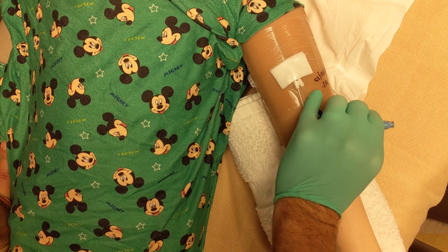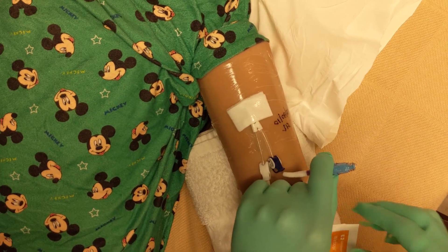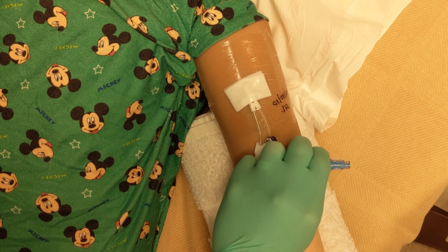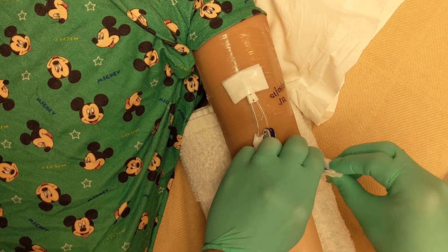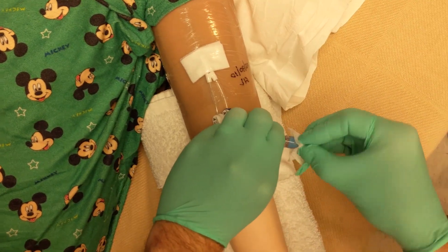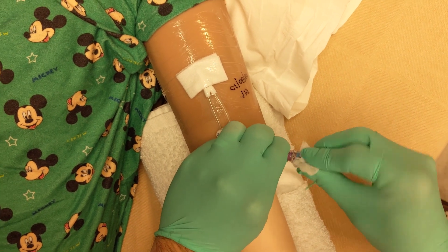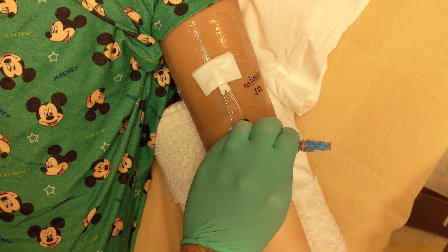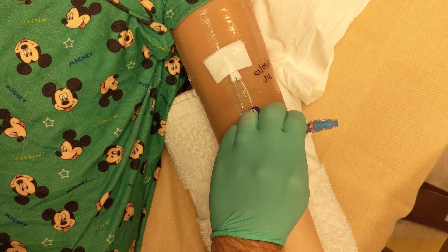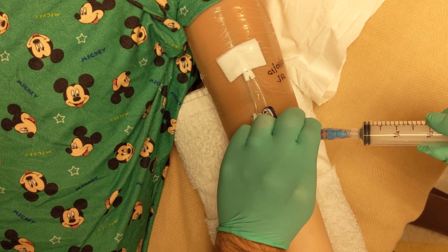Now you can remove the flush. Any time you access the central line — not just after a cap change, but when drawing blood, giving a medication, or any other access — take an alcohol swab and clean the entire hub. This time you do want to touch the front of the cap, and scrub for a full 15 seconds, then allow it to dry for a full 15 seconds. Both the 15-second scrub and the 15-second dry are very important. Once you've cleaned it, don't drop the line until you attach what you had intended to.